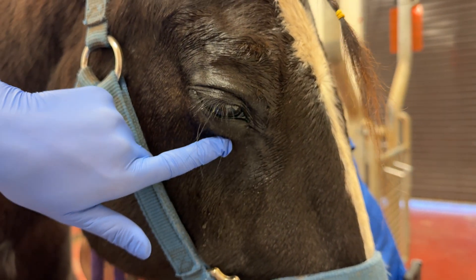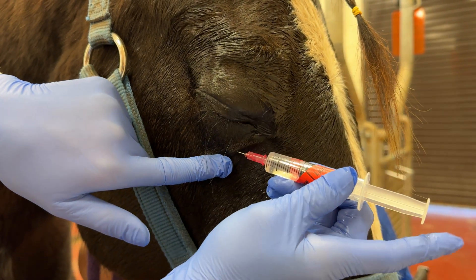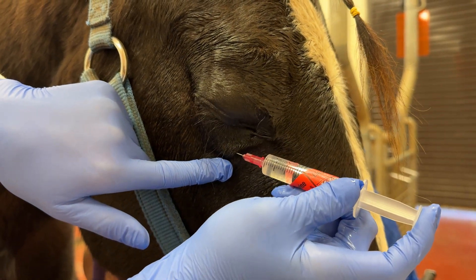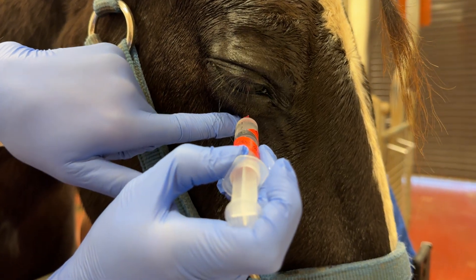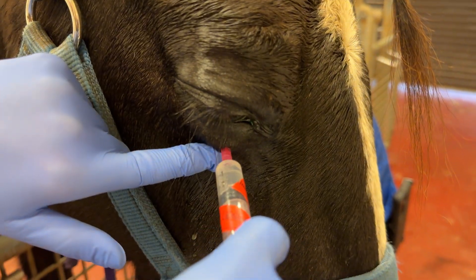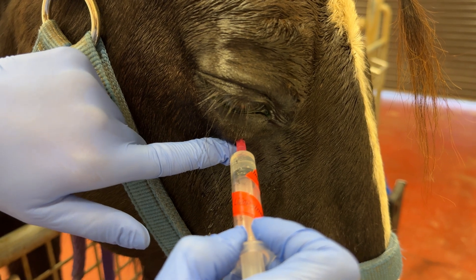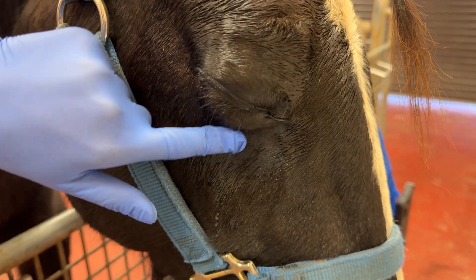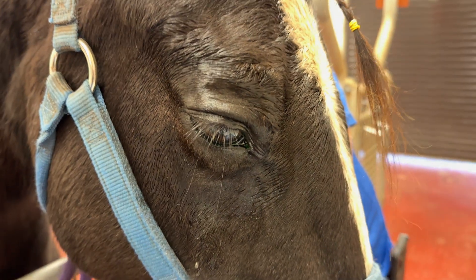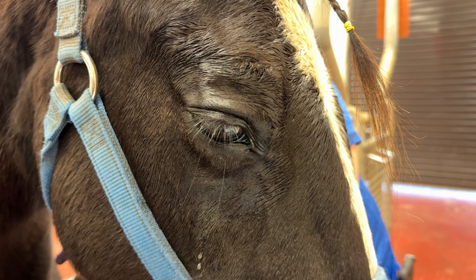So I do a local block right where I want the lavage line to go in, just a little bit in the skin first. And then I redirect the needle and go down towards the orbital wall. If you know where your orbital rim is, you will not end up harming the eye. That deep block really helps in order to numb the conjunctiva and the subcutaneous tissue.